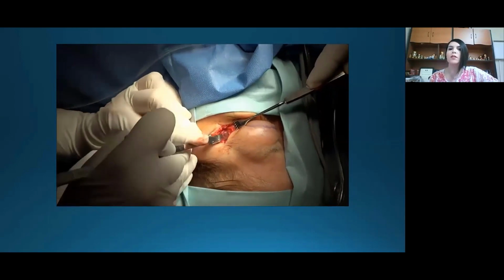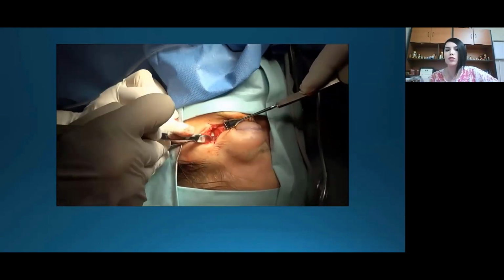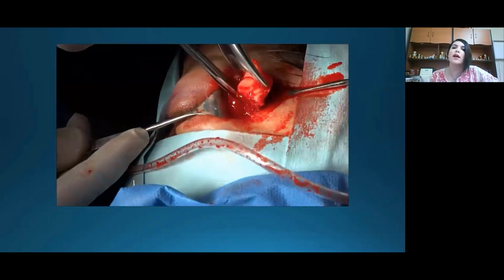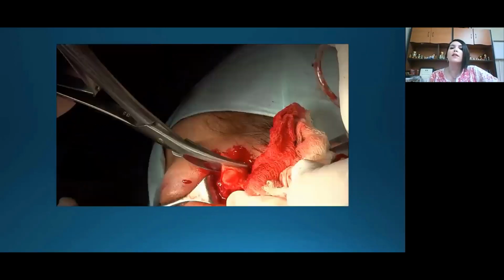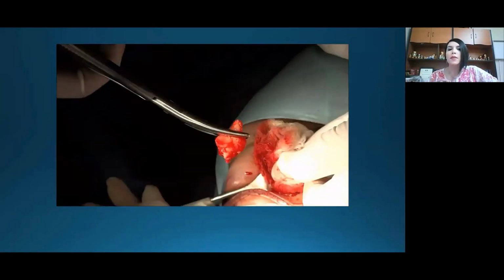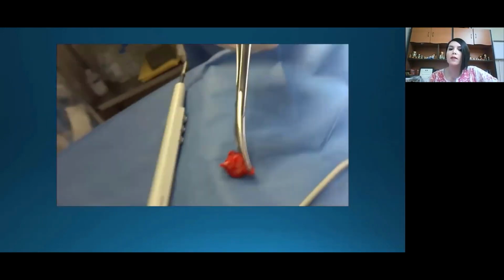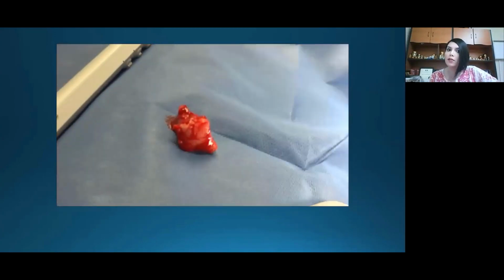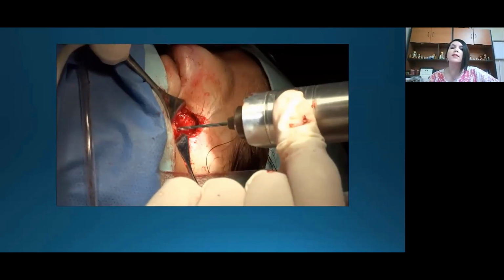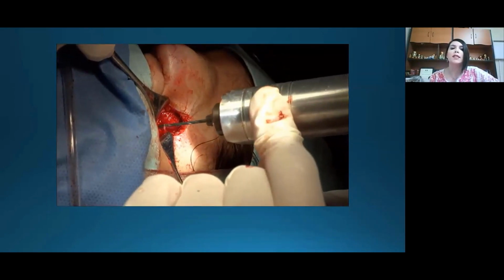Very carefully, because remember that you have an eyeball, a functional eyeball there. And after that, with a lot of care, we use an element to break the bone. This piece of bone, we have to be very careful and keep watching it, because we are going to replace that part of bone after the surgery to complete the orbit.